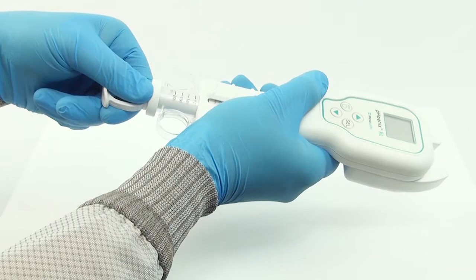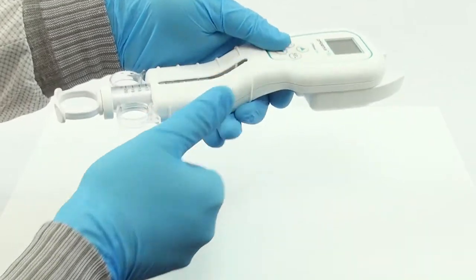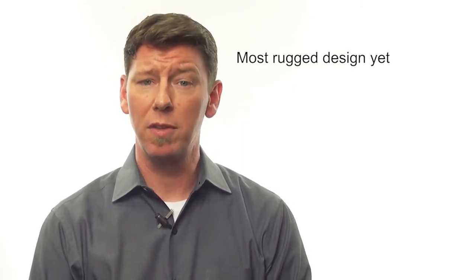The new ambidextrous design accommodates right- and left-handed users with a more ergonomic handle, offering safe and comfortable operation. The Phoenix XL was designed to be much more rugged, to stand up to the rigors of the clinical environment.